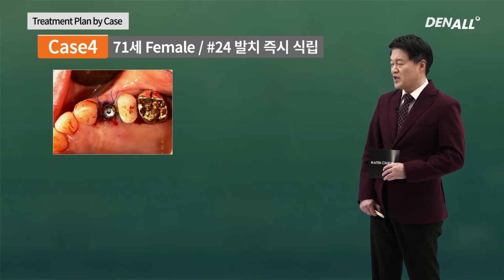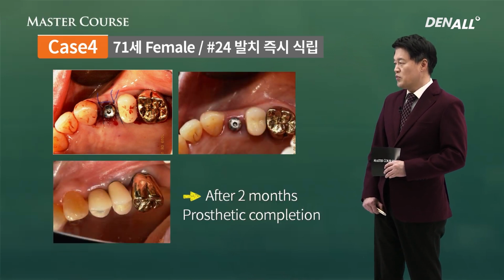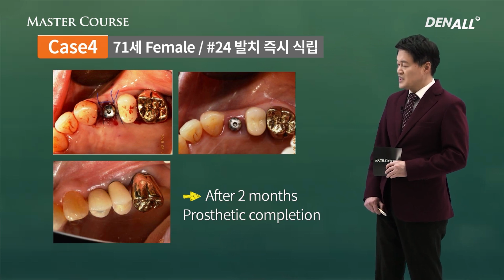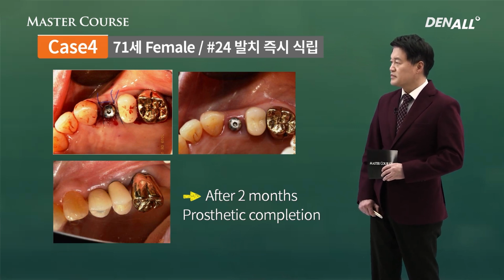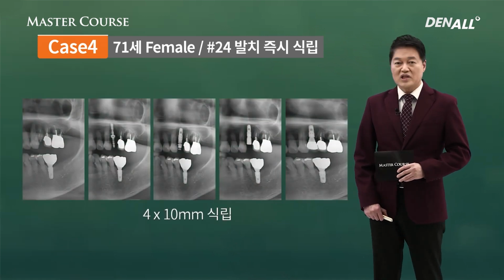Immediately, appropriate initial stability was achieved, healing abutment was connected, and suture was done. This is before taking impression. After 2 months, prosthesis was completed. Take a look at the X-ray. This is an image before extraction.